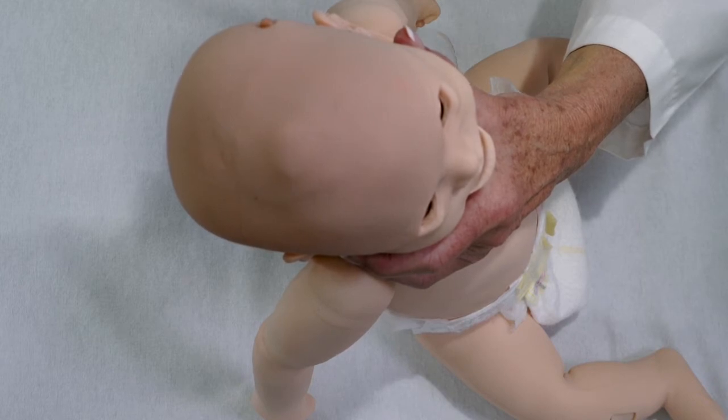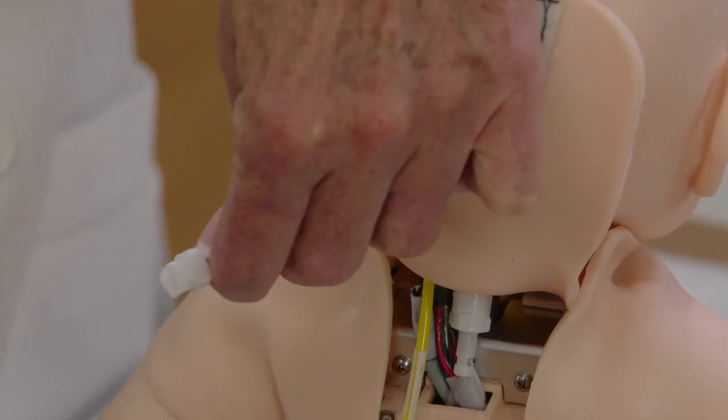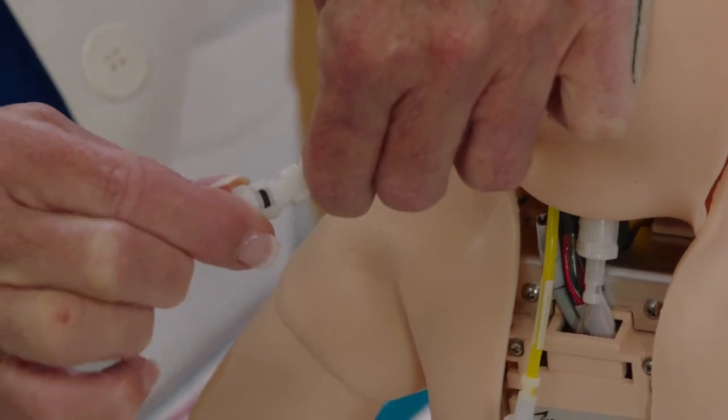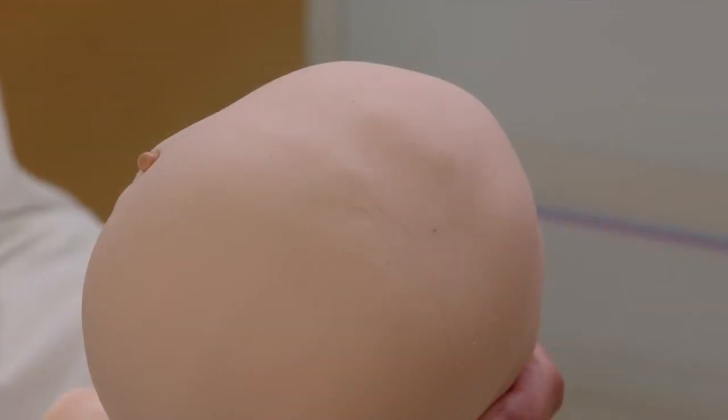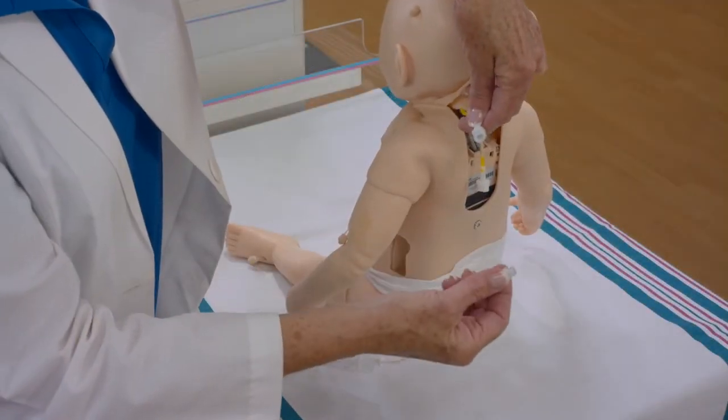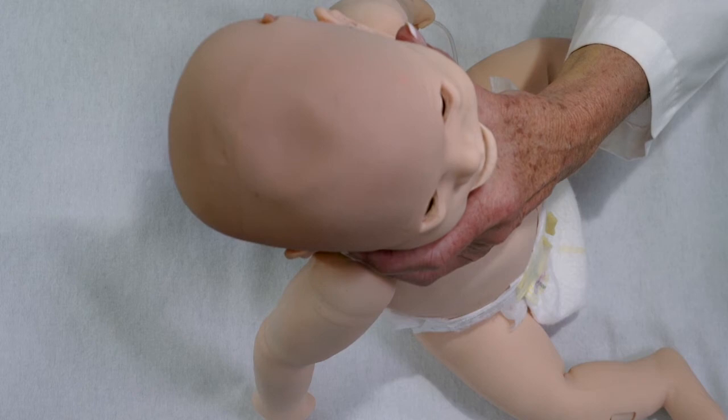To return to normal or depressed fontanelle, attach syringe and tubing to the fontanelle port and remove air for the desired appearance. Remove the pneumatic assembly from the fontanelle port and the fontanelle will retain the appearance set.